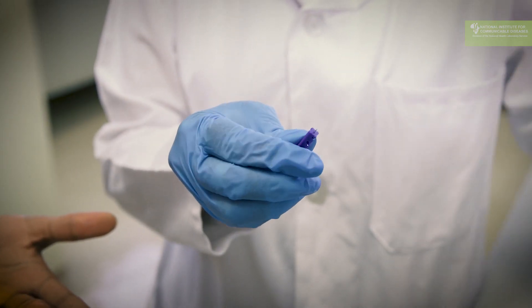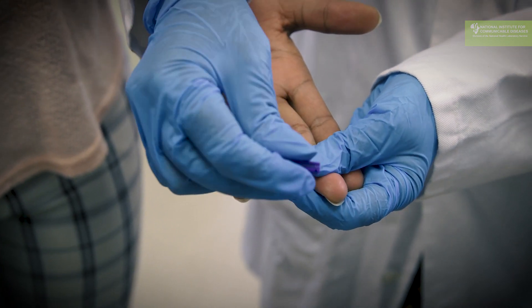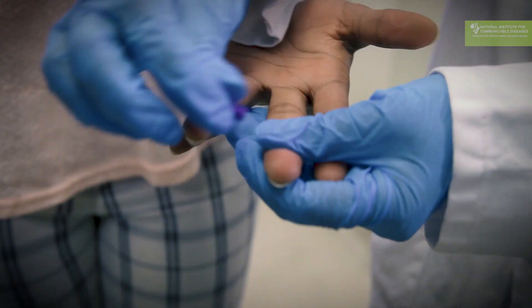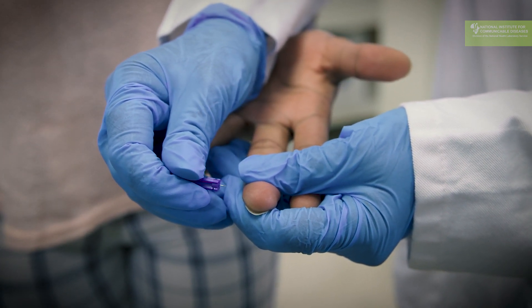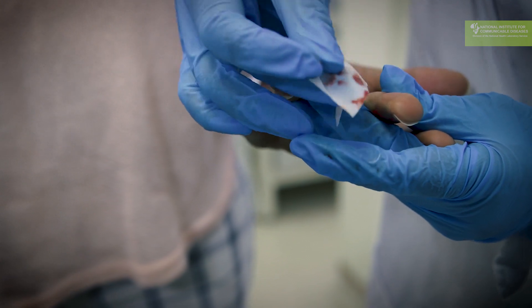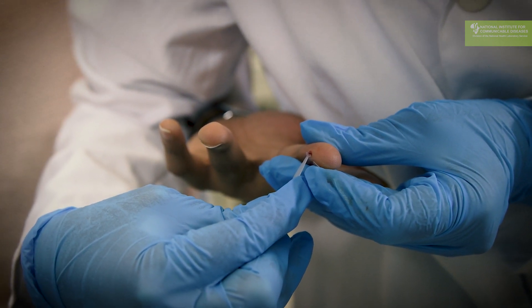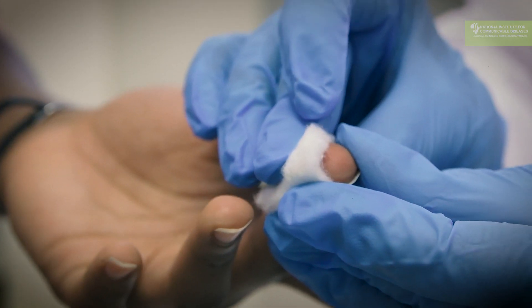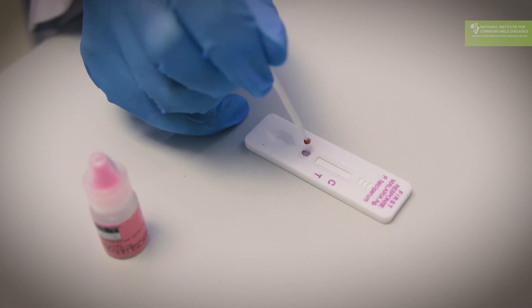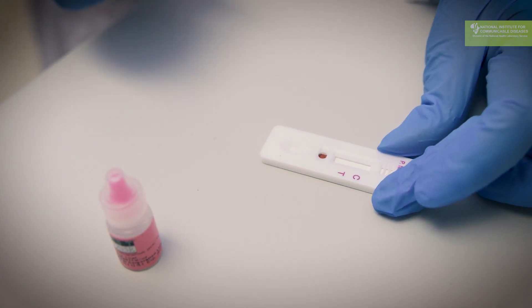Twist off the lancet lid to expose the sharp needle, which you use to prick the finger. Hold the finger firmly so blood pools, then prick off-centre in one smooth movement — never at the centre. Wipe the first drop off, then collect blood using the pipette. The pipette has a cup which ensures you collect enough blood. Take the blood and put it into the blood window of the RDT — that's all the blood required.